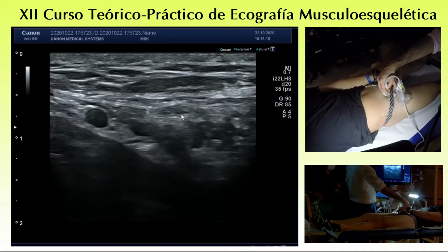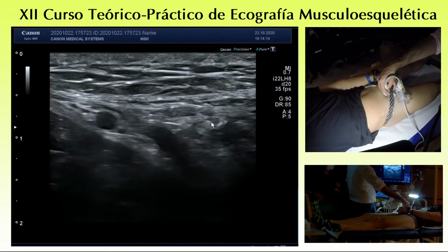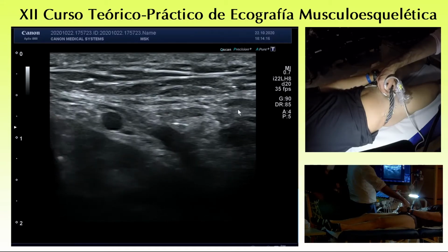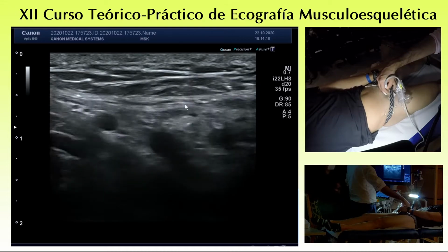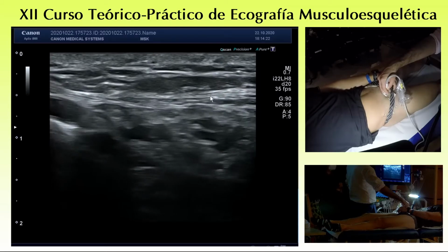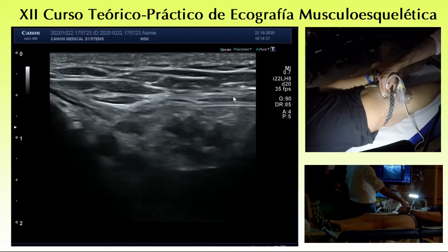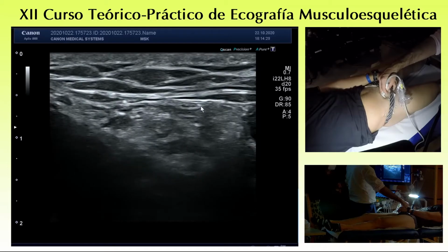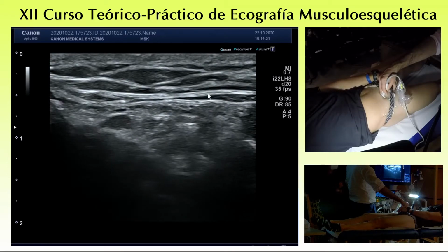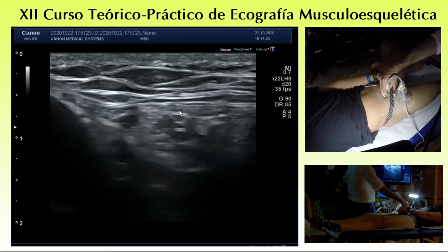If you look at this image, you understand why, in case of herniorrhaphy or hernioplasty, this small nerve running just above the cord could easily be injured. There are different fascicles at different levels. For instance, all this area could be involved in fibrotic scar tissue.